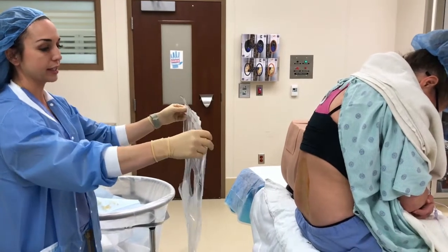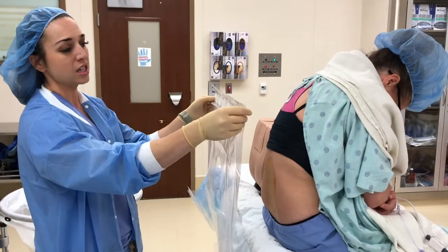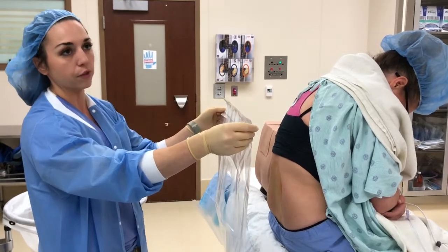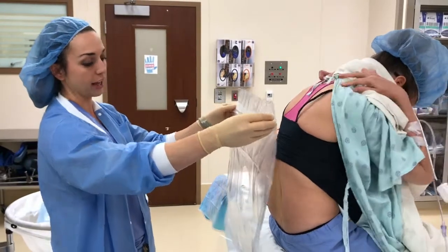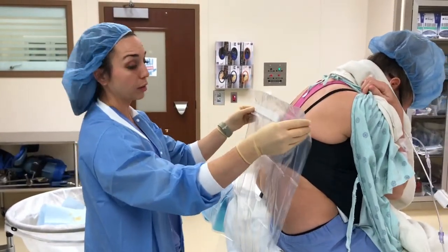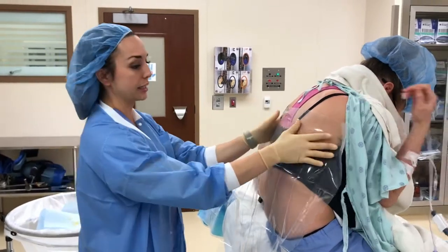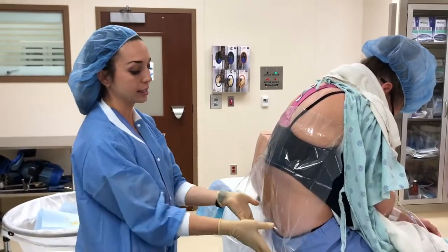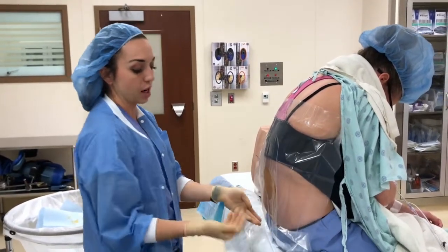The bottom part's always going to stick. Then you try to find a space towards her skin that you can stick it onto. Sometimes that can be difficult, but if you try to do it, the gown can shift, so just be aware of that. Then you just tell her, a little cold plastic drape here, and carefully place it. Try to make sure that everything remains sterile. I will typically tuck this under her bottom, just so it's not flapping in the wind over here.